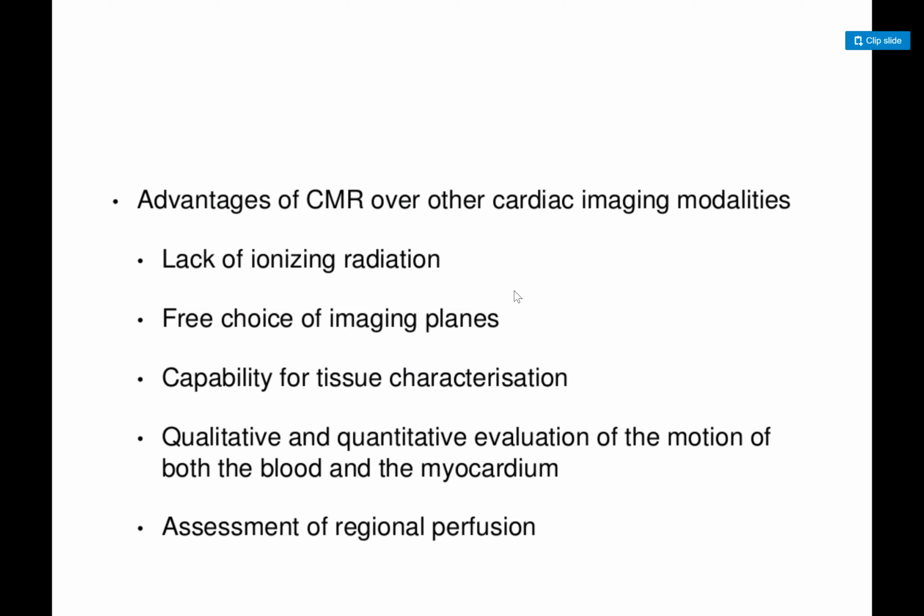So in pacemaker patients, or where there are wires in the body, we can change a setting in the MRI where we can have the MRI magnetic waves weaker in certain portion of the body so that it doesn't heat it up.